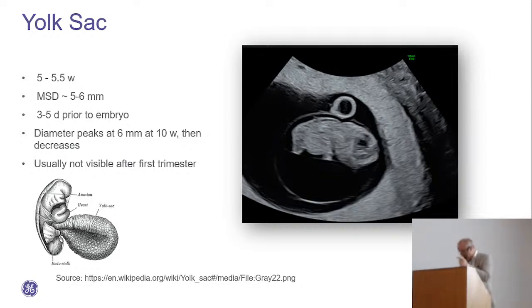And then maybe the next step, what you could do is, because you know on your system also in the clinic, you can save this data as a 3D printing data. Just try to, maybe you can print one early pregnancy. Why not? And then you can put it next to the ultrasound machine and you can say, so this is so small what we can see in the ultrasound system. So maybe you could try.